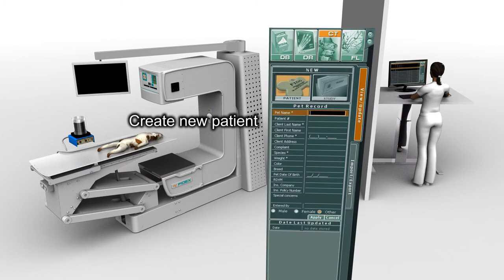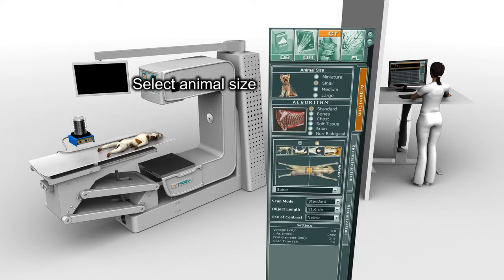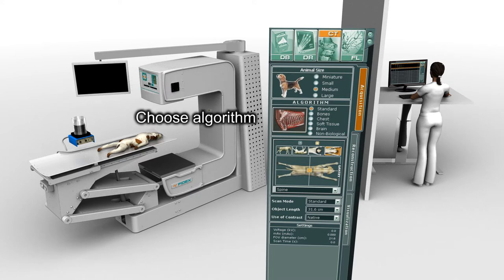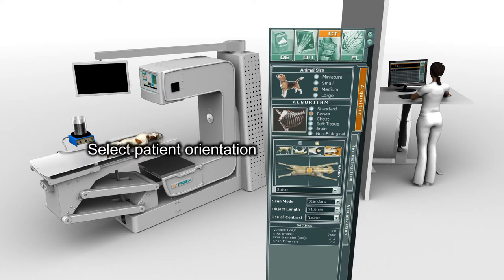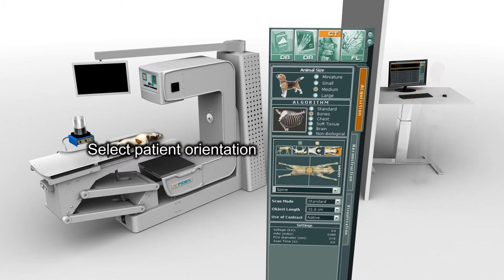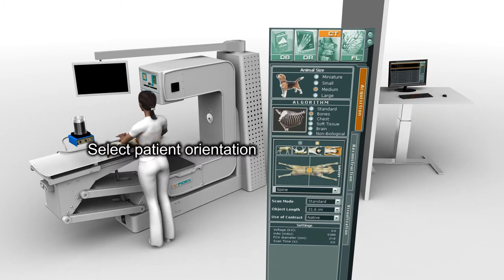Next, create a new study or enter the details of an existing patient as shown. Select the patient size using the icons as reference, choose the desired algorithm, and select the patient orientation on the table relative to the stationary gantry.